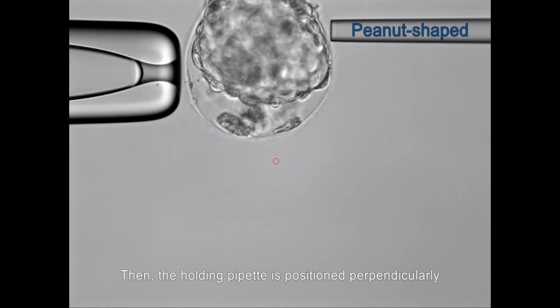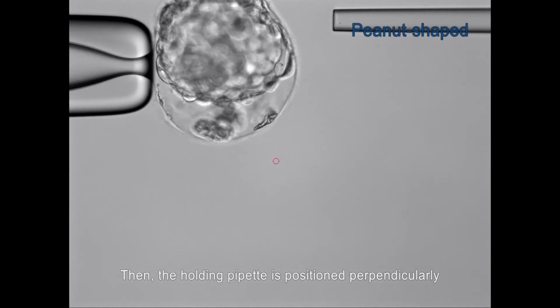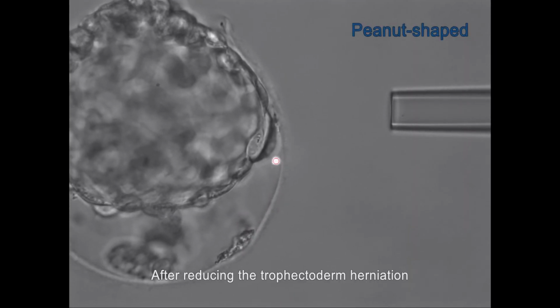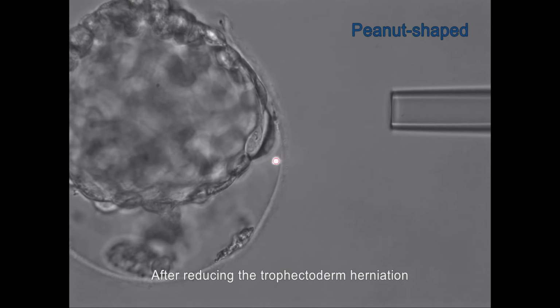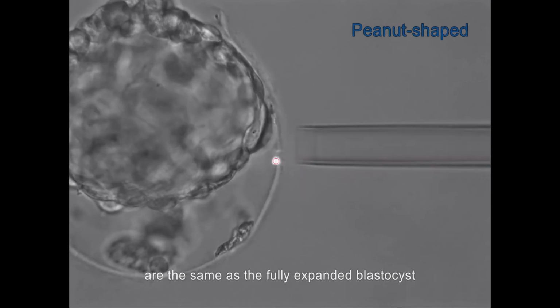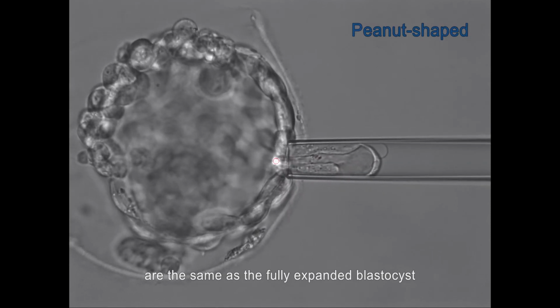Then the holding pipette is positioned perpendicularly to the axis of the herniation of the trophectoderm. After reducing the trophectoderm herniation, the steps of the trophectoderm biopsy are the same as the fully expanded blastocyst.